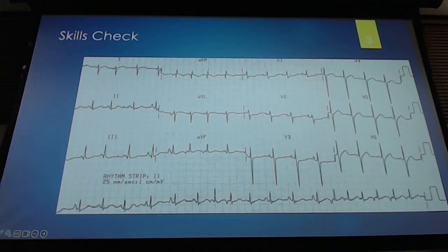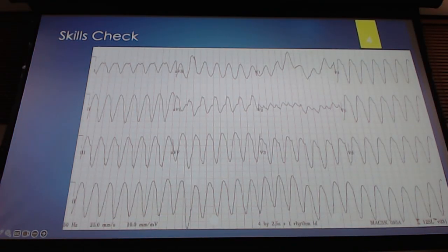All these P waves, right? We've got a lot of P waves, which is good. We see the P waves. If there was atrial fibrillation, we really wouldn't see those P waves. We might see something that maybe looks like a P wave every now and then, but not clear-cut P waves. Here we have clear-cut P waves, but they're in different morphology, meaning that it's coming from different areas of the atria that are trying to pace, sending out different foci. We have different foci in the atria sending out depolarization, and we're going to capture that on the ECG.